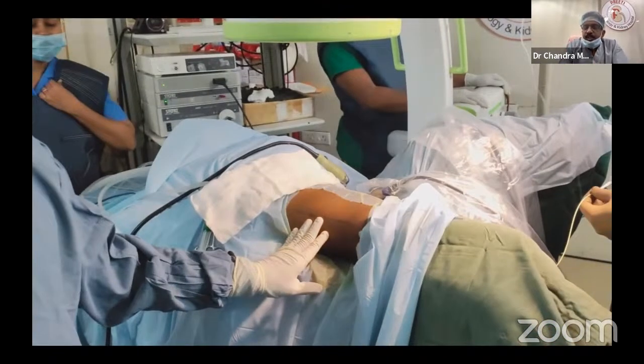So this is a position which most of us wonder about, what is the position. As many of our previous videos have shown, the ipsilateral side, in this patient we are doing right side PCNL, will be slightly on the lower side. The opposite side leg is in normal lithotomy, and one folded towel below the shoulder blade will give this position. It is supine with a little tilt. A little tilt means how much? Maybe 25 to 30 degrees. With that, you can easily see the 12th rib, 11th rib, and the paraspinal region also.